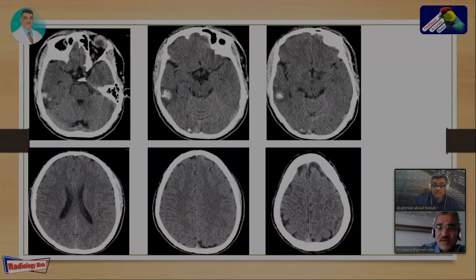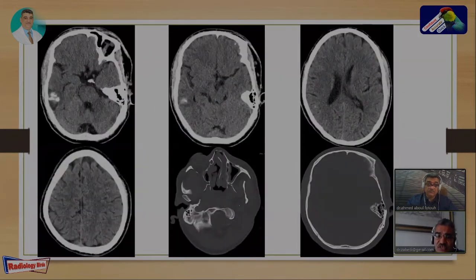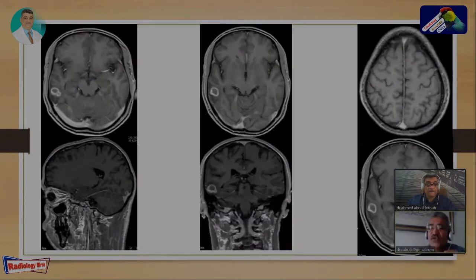We did a control because the patient suddenly had convulsion and after that was comatose, and they asked for a controlled CT scan, and we did the controlled CT scan, and it was the same. There is no change at all, at least for me. I didn't see any change. This is a case for further investigation, and we need the MRI anyway.